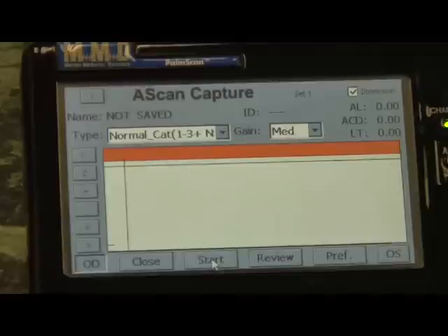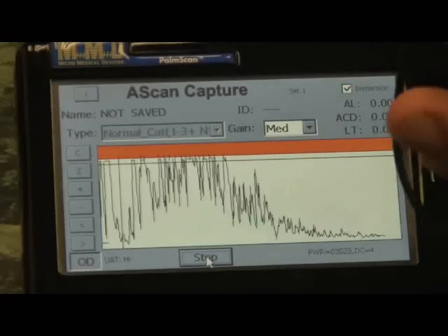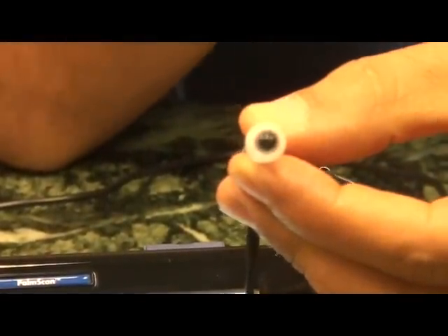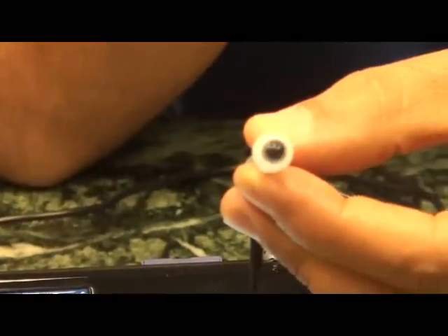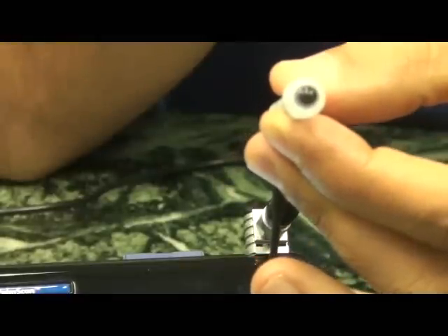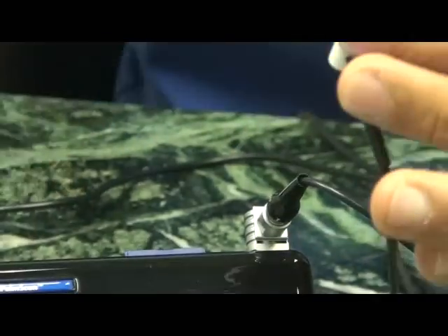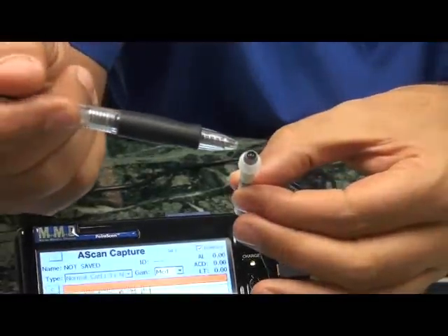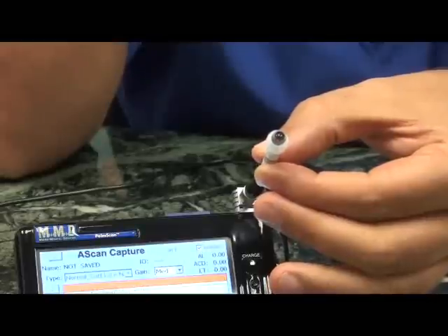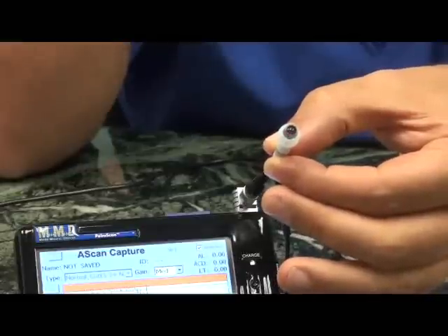To start scanning, press the start button. The red LED will be blinking. At this time, have the patient cover the fellow eye — so cover the left eye. After properly anesthetizing the eye, slowly approach the eye until the cornea comes in contact with the meniscus. I usually instruct the patient to keep looking at the blinking light as I touch the meniscus to the eye.